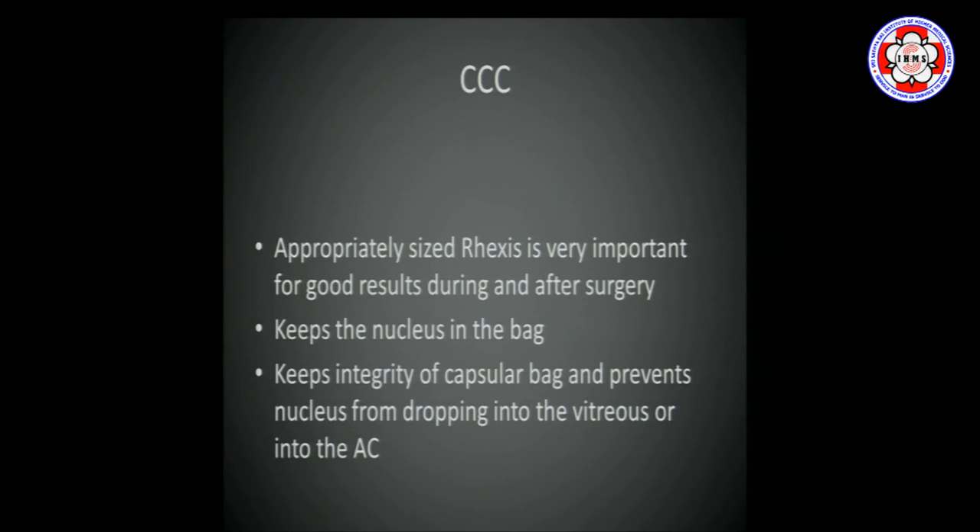How does it help you? It keeps the nucleus inside the bag when you are operating, does not let the opening extend, and does not let the nucleus drop back into the vitreous or come up into the anterior chamber — in which case you could have endothelial cell damage. So having a good rhexis makes your surgery much more safe and predictable.